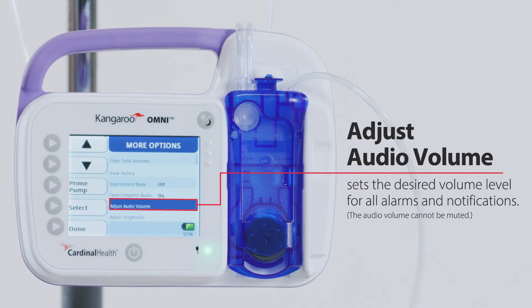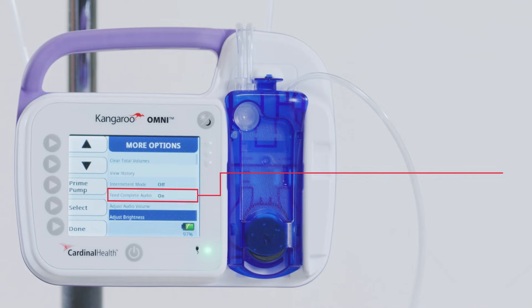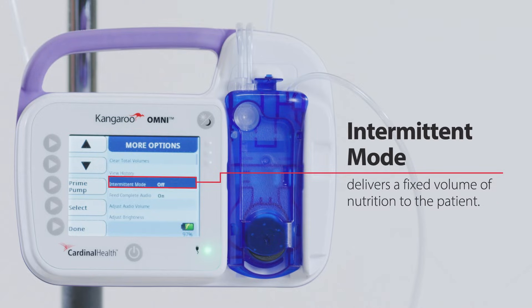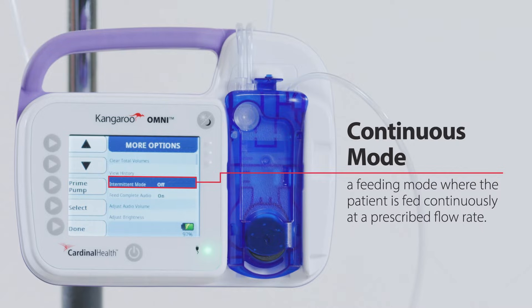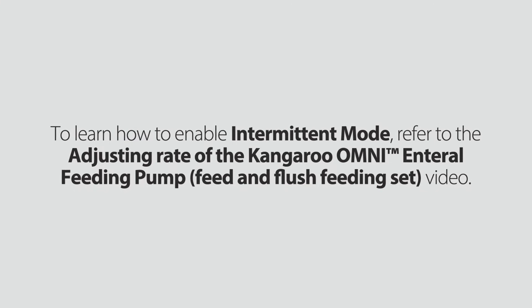Please note the audio volume cannot be muted. Adjust brightness changes the display backlight level. Feed complete audio provides audible notification when feeding is complete; it can be turned off to avoid waking patients during nighttime feedings. Intermittent mode delivers a fixed volume of nutrition to the patient. The Kangaroo Omni enteral feeding pump can be configured to deliver a single feed or multiple feeds at fixed intervals. The pump is initially set to continuous mode, where the patient is fed continuously at a prescribed flow rate. To learn how to enable intermittent mode, refer to the adjusting rate video.